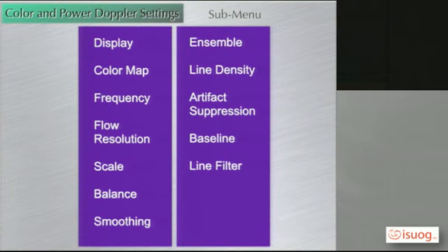This is the submenu page. Each manufacturer may have different options in their submenu selections. However, the features are very similar. Let's now explore what these features are and how they may affect the image.